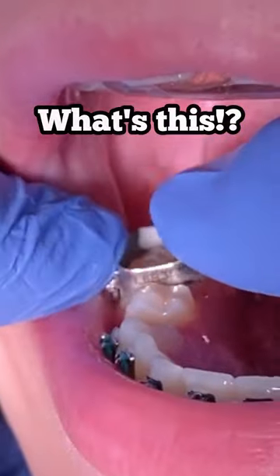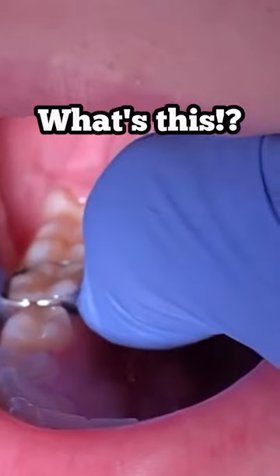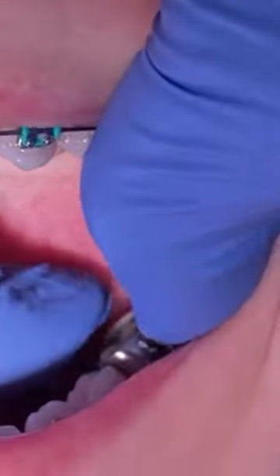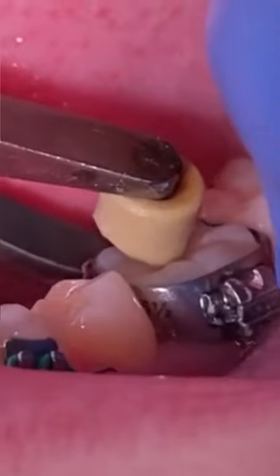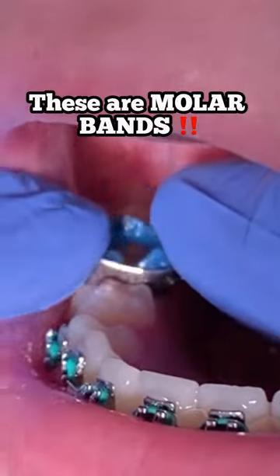Hi everyone, this is Abby, your hygienist here at Tooth Time Family Dentistry. Today's video we're going to show you how we seat molar bands. Before you seat the molar bands, you have to make sure that you measure them, make sure that they seat coronal to the tooth, and it fits really great — nice and snug and tight.